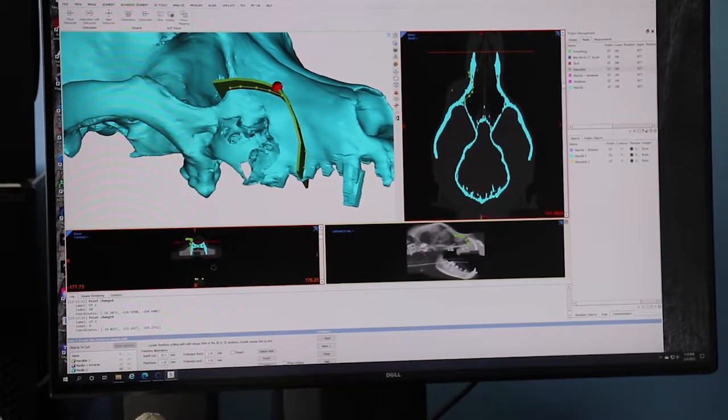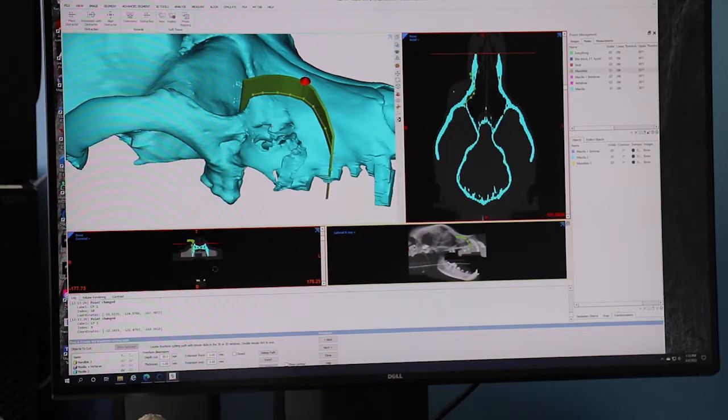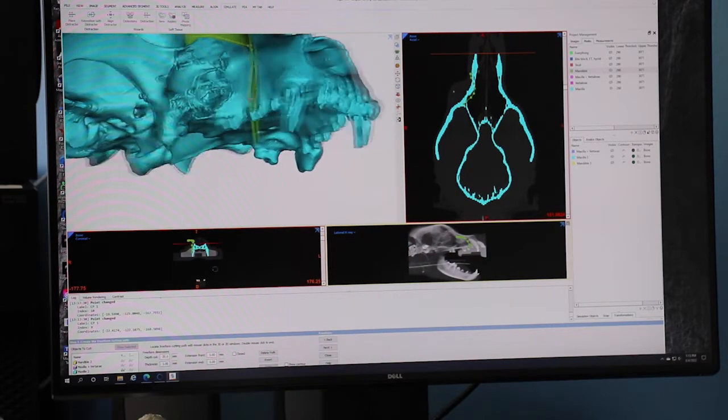An overview of what I do would be to take imaging studies like a CAT scan, CT, into a dedicated software where I could create 3D models of a patient's both head and pathology, the disease process itself. And then I use the three-dimensional models in a virtual environment within the software to perform the surgery, practice the surgery. And from there I can print 3D models. And all of that is all to speed up the surgical procedure itself, rehearse it, and minimize complications.